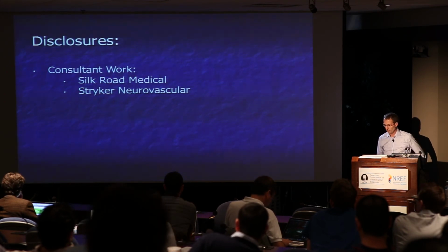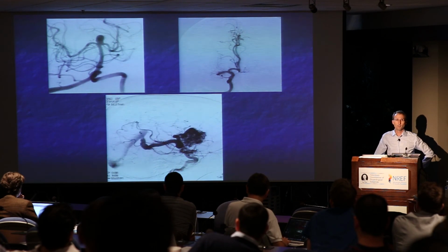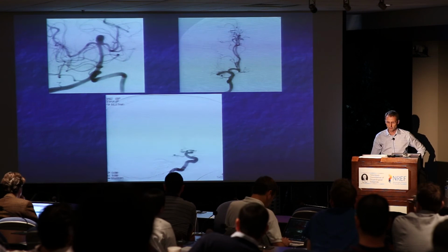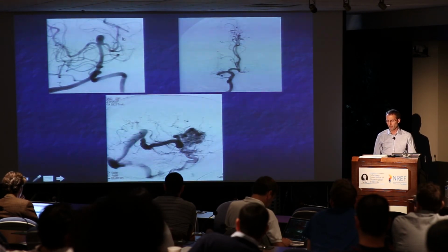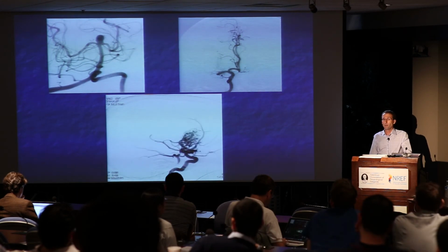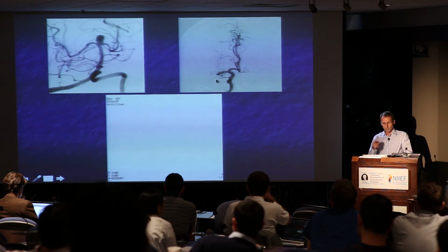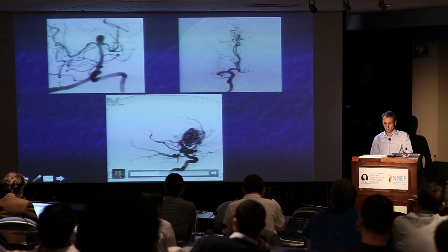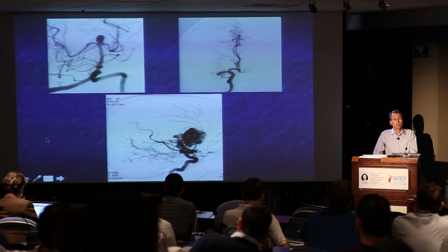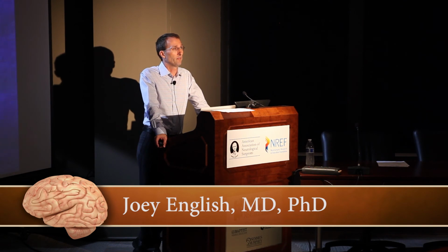I'm going to start by showing a few pictures of some of the different lesions that we are talking about at this conference. We've had great discussions this morning, three talks about the technical aspects of treating aneurysm. Jay's going to speak about endovascular treatment of large vessel occlusions tomorrow, and my colleague Lucas, who was kind enough to switch topics with me, is going to talk tomorrow about our approach to AVMs. So I'll submit to you that obviously these are very challenging cases.